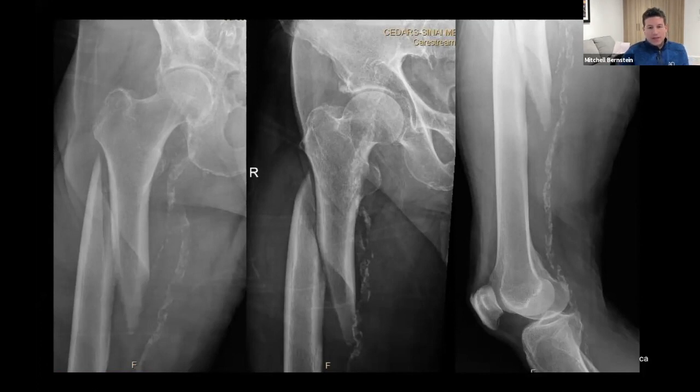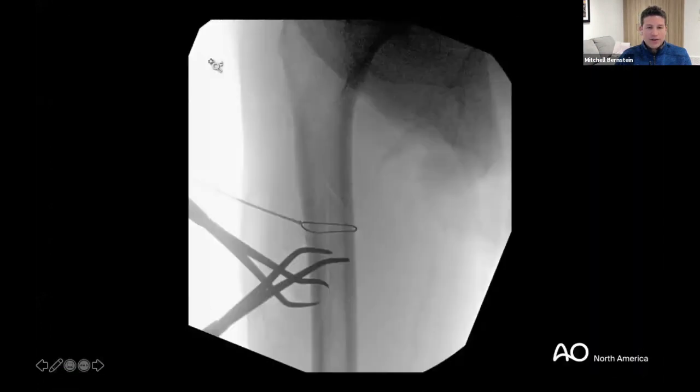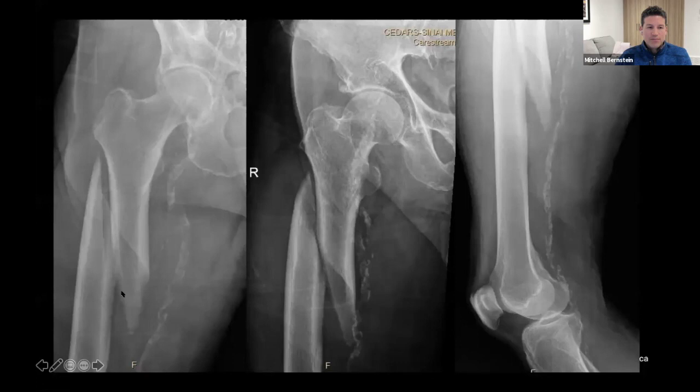The other, sometimes I get nervous, even though it's a load sharing device, these folks don't have the highest healing rates. So even with a gap, I find sometimes the compliance of the fixation is wrong and they develop atrophic non-union. So I like to get them reduced. The other is, what kind of bowing does the patient have? If the patient's like 90, and we always have these fragmented x-rays because it's trauma, is there a bow in the coronal plane? I worry about that as well.